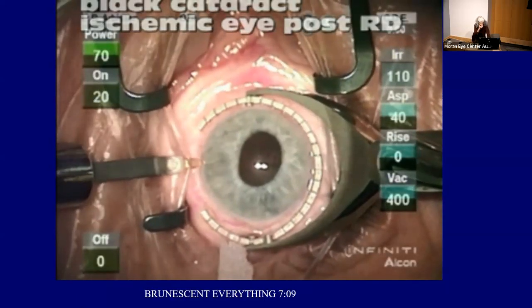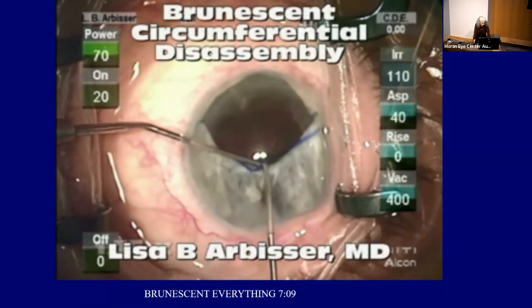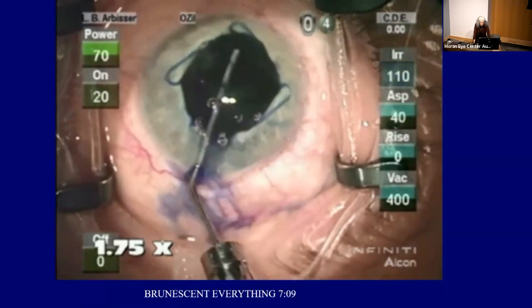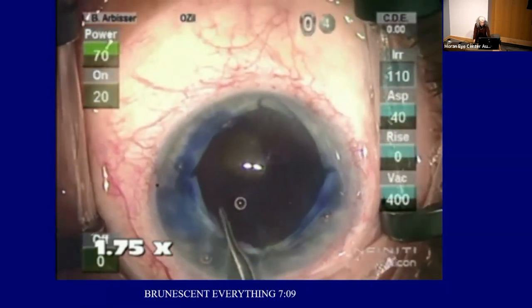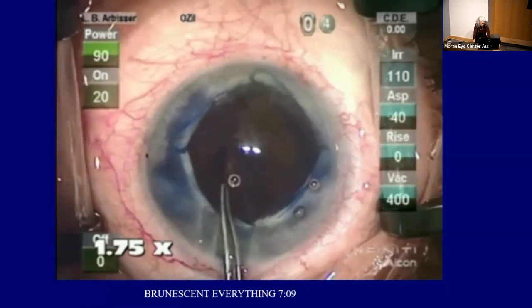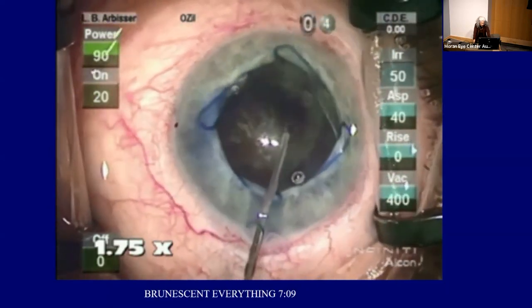Here are a number of really more challenging cases. This is a black cataract because it was a retinal detachment from 10, 15 years ago. They told them just to leave well enough alone and never touch that eye. But the other eye developed enough of a cataract and had a retinal tear that I treated. So we decided to do this eye. And it needed a Malyugin ring. It had a very floppy, translucent iris because of the ischemia that it had.